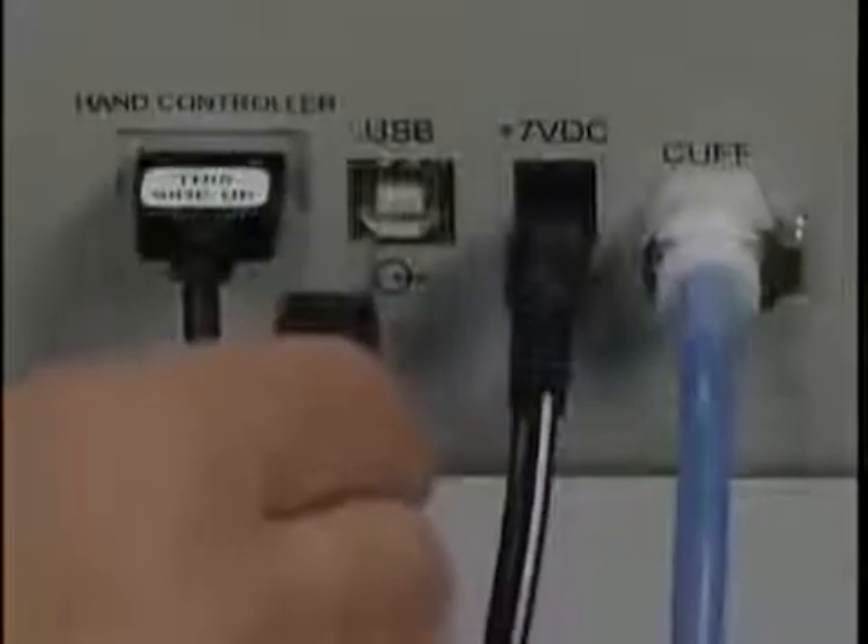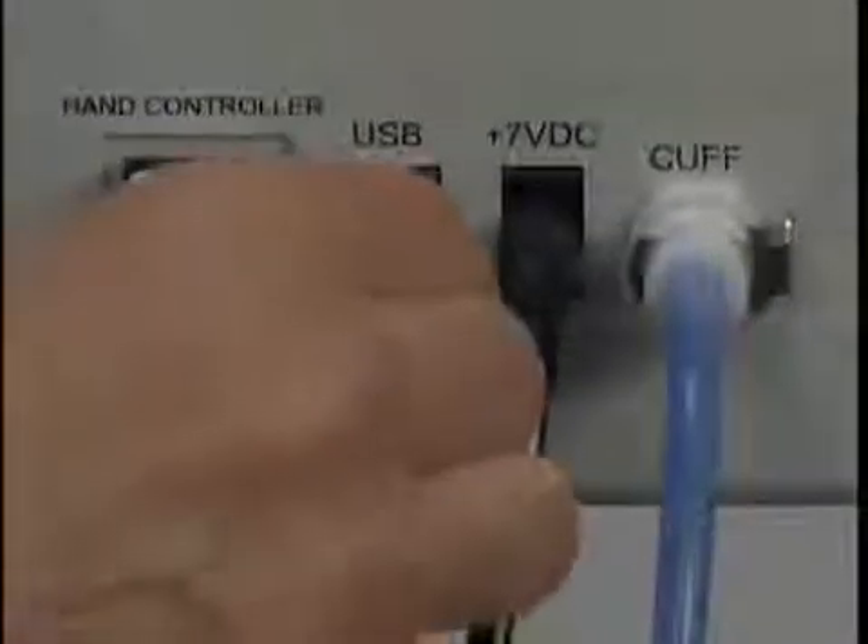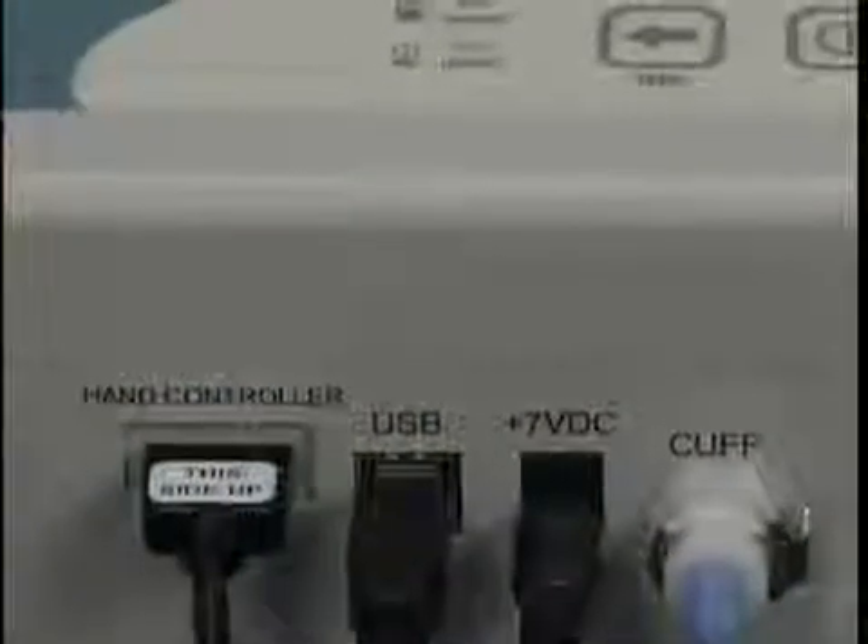The last connector is for downloading to a personal computer. For safety, exams cannot be conducted while the Vista AVS is connected to a personal computer through the USB port.